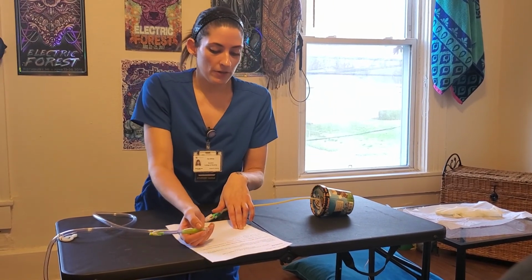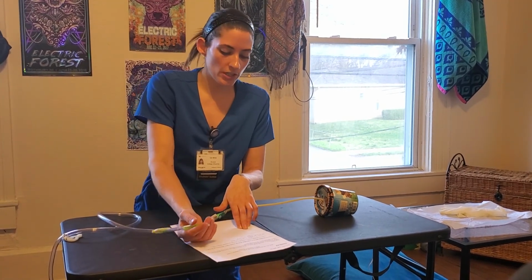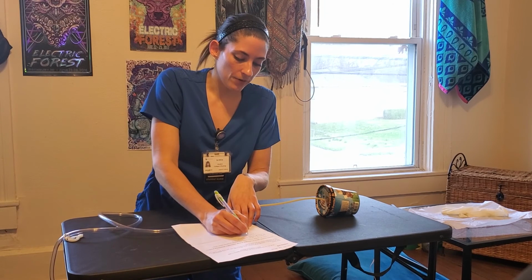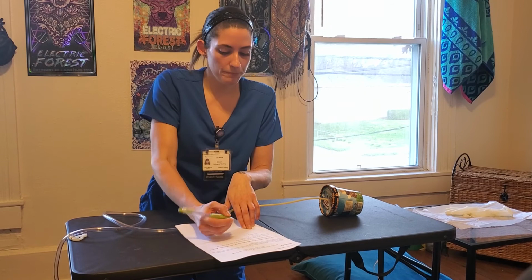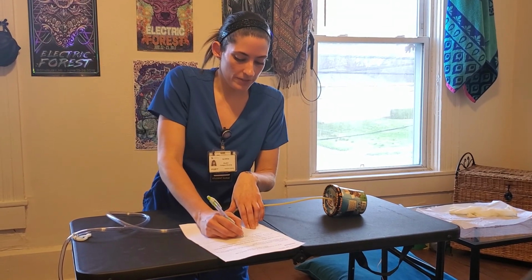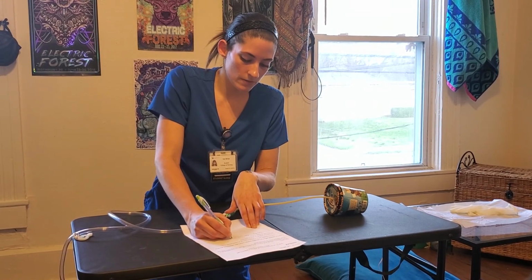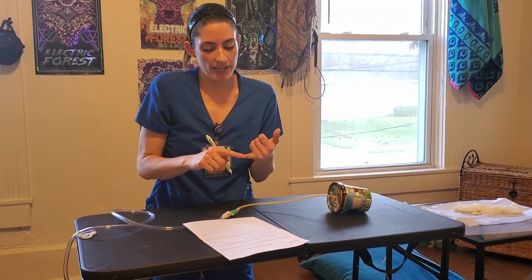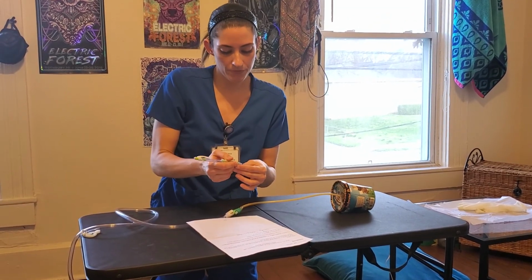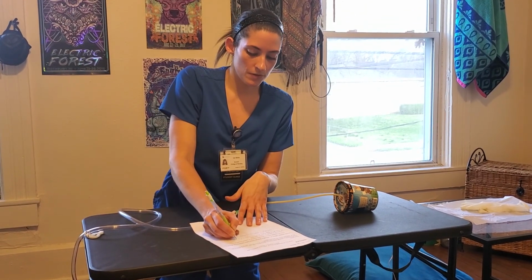Patient didn't report any pain or discomfort during the insertion process. We did get some urine output during the insertion. It was slightly cloudy. Patient reported that they did not have any allergies to betadine or latex. So we have the date, the time, my initials, and a few notes on how the procedure went.